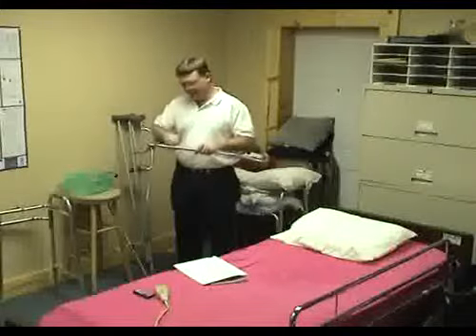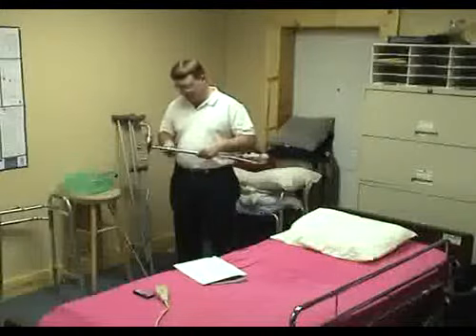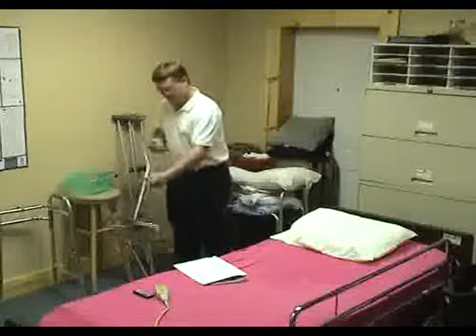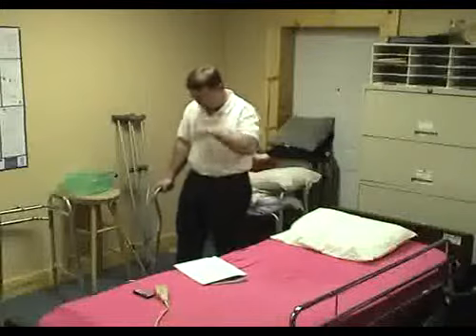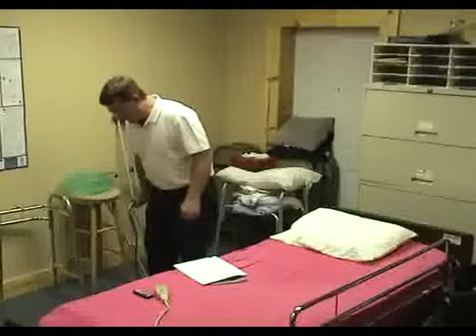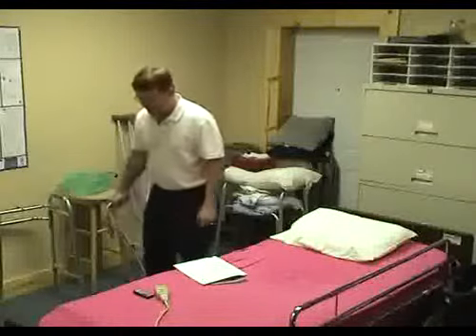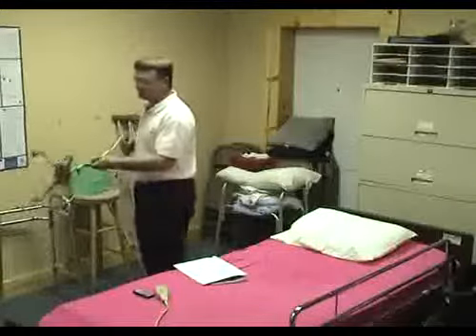If it were to be for the right hand, spin it. Now the flat side is to the inside for the right hand. Use this one the same as you use that one. Bad foot forward with the cane, then bring the good foot forward.